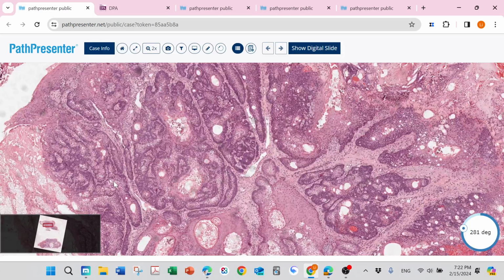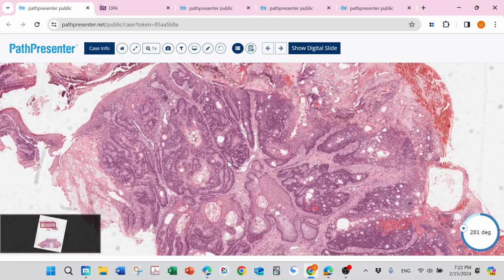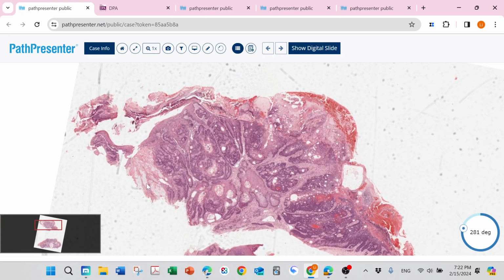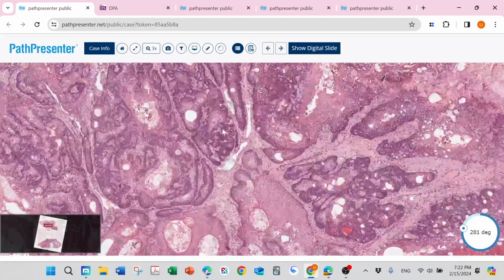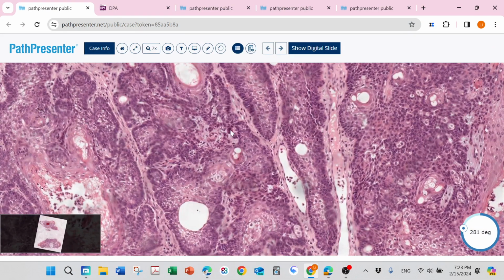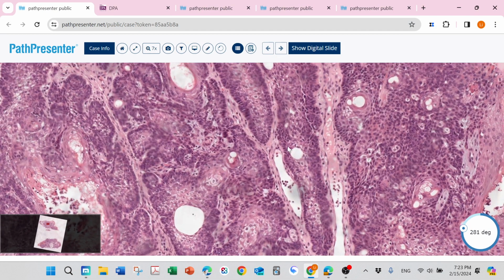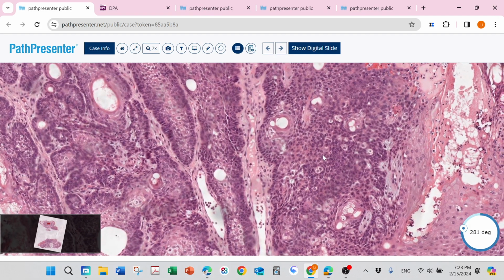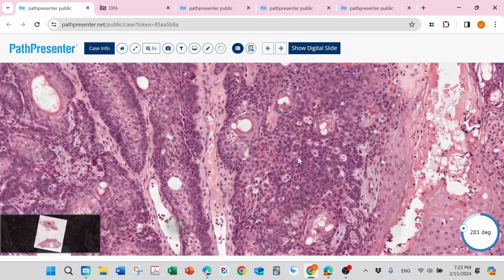And you need to bear in mind that for sebaceous adenoma and sebaceoma, we need to see kind of well circumscribed, we could not see infiltrative growth. And when we see the cytology, sometimes you may see mitosis, but you could not see atypical mitosis. Kind of a little bit of atypia, but not dramatic atypia.